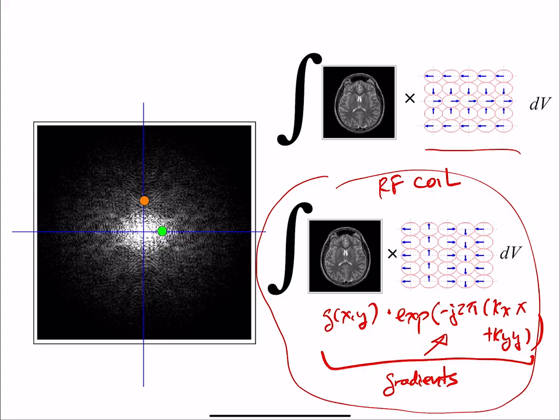MR is one place where you think about real and imaginary numbers all the time, and we actually measure them. They're not really imaginary numbers, but that's a very useful concept because the spins are basically phasors, and we're always looking at where they are along that XY plane, so thinking about the real and imaginary components is really useful. Basically, it cuts your work down by at least a factor of 2, right? Because otherwise you have to deal with sines and cosines. If you deal with complex exponentials, you can just use e to the j. So things are just much simpler.